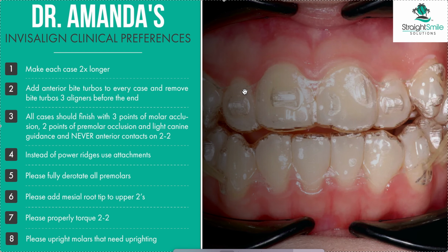long-term retention plan. Now, remember, one set of clear retainers, assuming they're Viveras, well, Vivera doesn't come in one set, but if you made them in-house or ordered them from another lab, one set is not going to last them more than 6 to 12 months. Really, they just become non-functional. They're not going to keep your teeth straight for a lifetime. You need to come up with a plan.